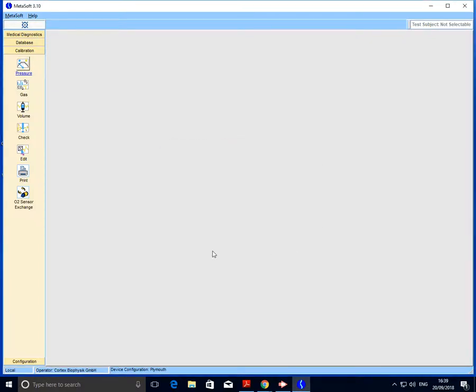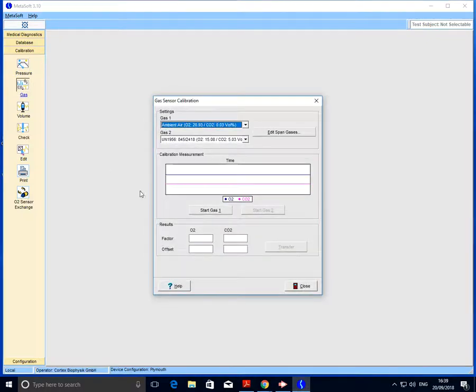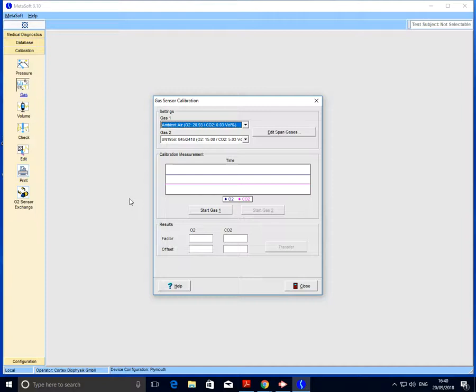We can now move on to the gas calibration. The gas calibration has two components, the first being an assessment of ambient air. We need to grab hold of the white sample line, drape it over the side of the Cortex, and most importantly make sure it's away from anyone breathing. Once we're happy that it's in a suitable location, we can go ahead and hit start gas one.